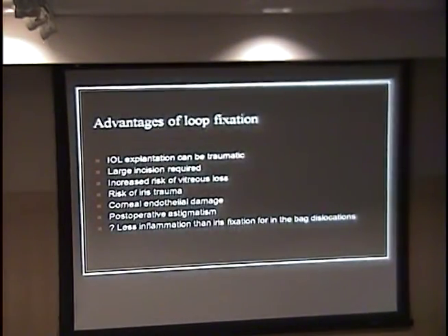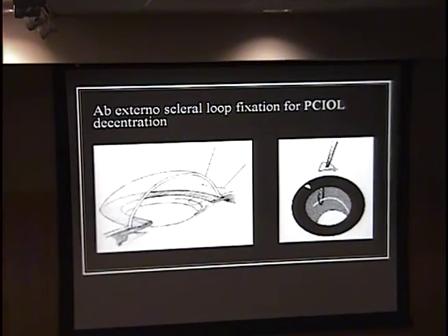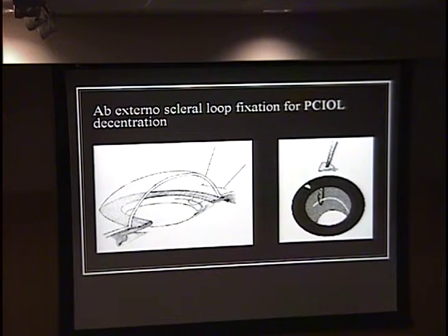So there are obviously advantages to loop fixation. You don't need to take out the lens. It's a larger incision. If you were to take out a lens, there's increased risk of vitreous loss, risk of iris trauma, postoperative astigmatism, and if you would do it this way, there's potentially less inflammation than iris fixation for in the bag dislocations. And this is just showing what you end up with, a loop there, and then you could put one on the other side too. It's just one is going under, one's going over, and then you would tie the knot out here.